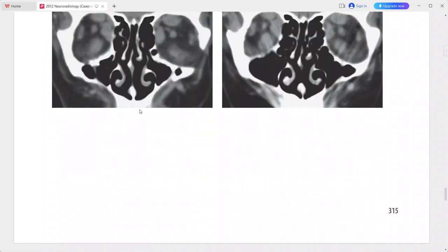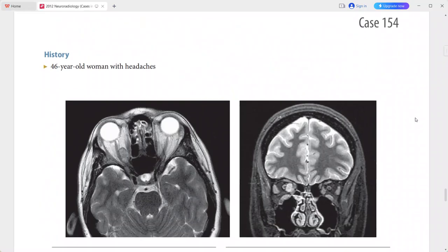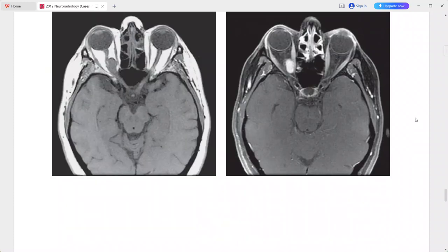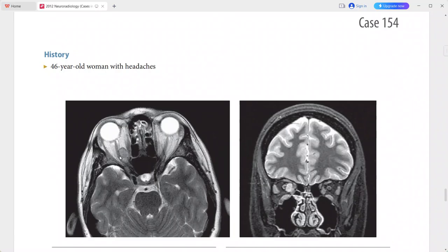Next is a 46-year-old woman presenting with headaches. There is a well-defined intraconal mass in the right orbit between the medial rectus and the optic nerve, displacing the optic nerve laterally without primary involvement of the nerve. On T2-weighted MRI, this mass has increased signal relative to the muscles.